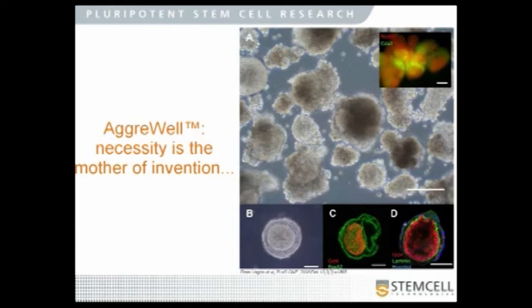And people in the audience who work with hESCs and EBs may also be looking at this and thinking that it doesn't look anything like the EBs that you prepare. And that's a third source of heterogeneity, is that because the process for making them is so difficult to quantify, it winds up being fairly idiosyncratic. And so two people between different labs or even within the same lab will often wind up generating very different preparations of embryoid bodies despite following the same protocol.